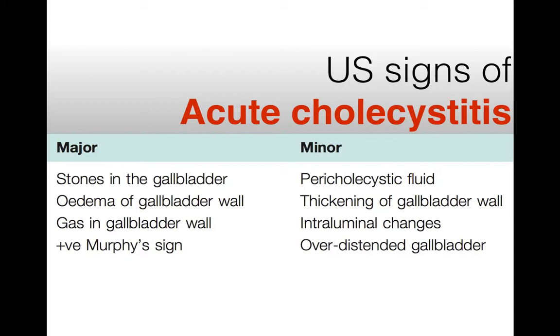It is obvious when you put the probe, you see the gallbladder. When you keep the deep breath, the gallbladder is just under your probe. You put the pressure, and that's not a blind Murphy sign. It's very obvious, you visualize the echo-Murphy sign, right?